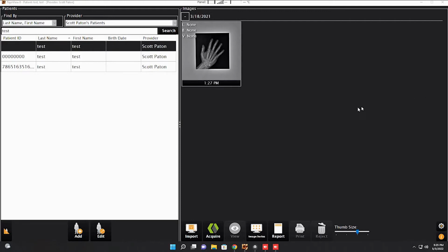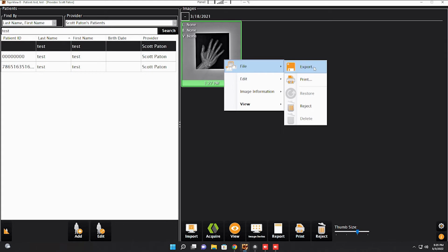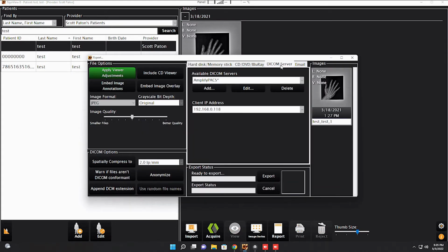In this video, I'll show you how to fix TigerView not sending images to AmplifyPACS. First, select the exam, right-click on it, click File, Export, and go to the DICOM server. Ensure AmplifyPACS is selected and click Edit.